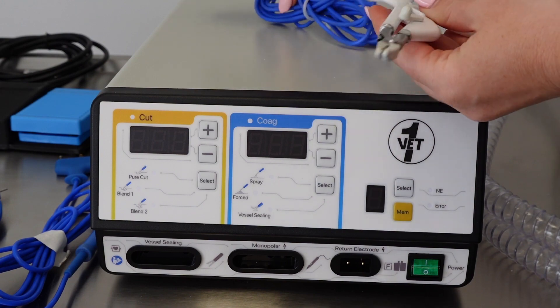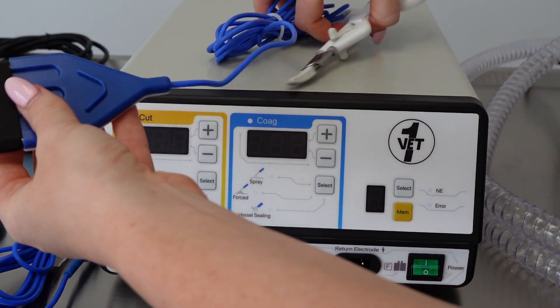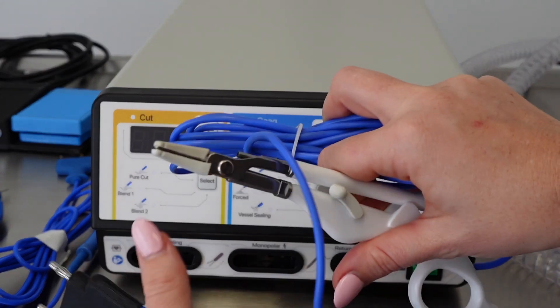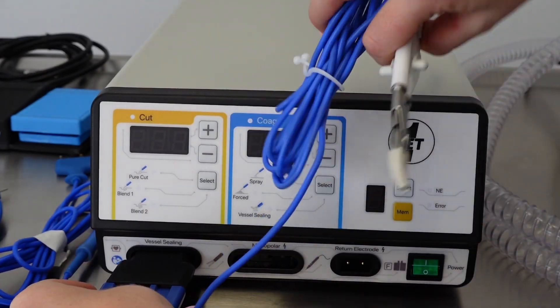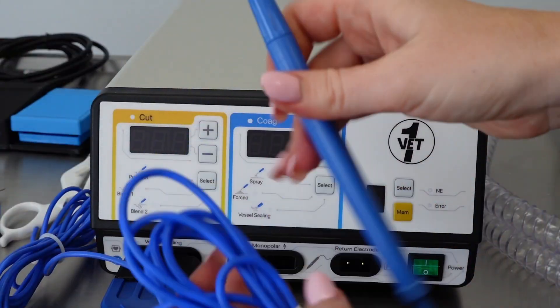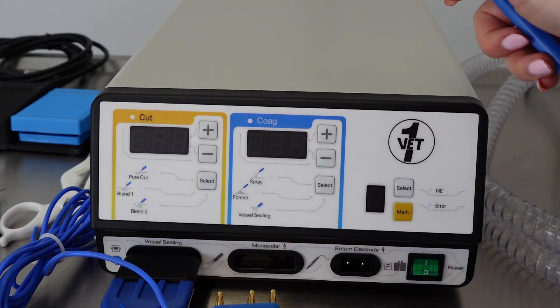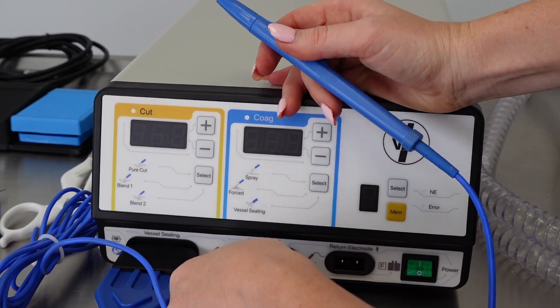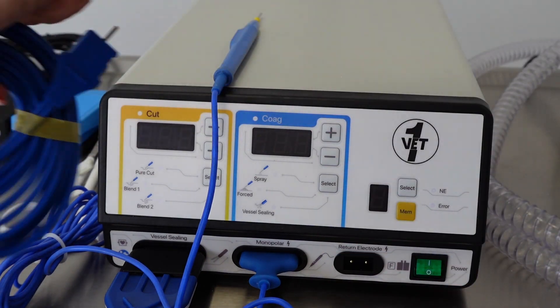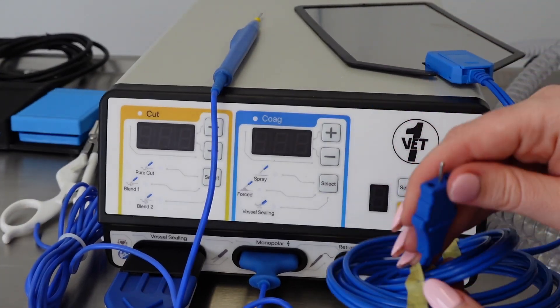Let's go ahead and attach the accessories to the front of the unit. The vessel sealing attachment goes onto the left-hand side. You'll be able to tell which one fits into each port because of the prongs on the attachments — make sure it's in there nice and snug. Now let's attach the monopolar cutting section; you can see the prongs are different on this one. This one goes into the middle port. The return electrode plate attaches into the port on the right-hand side.